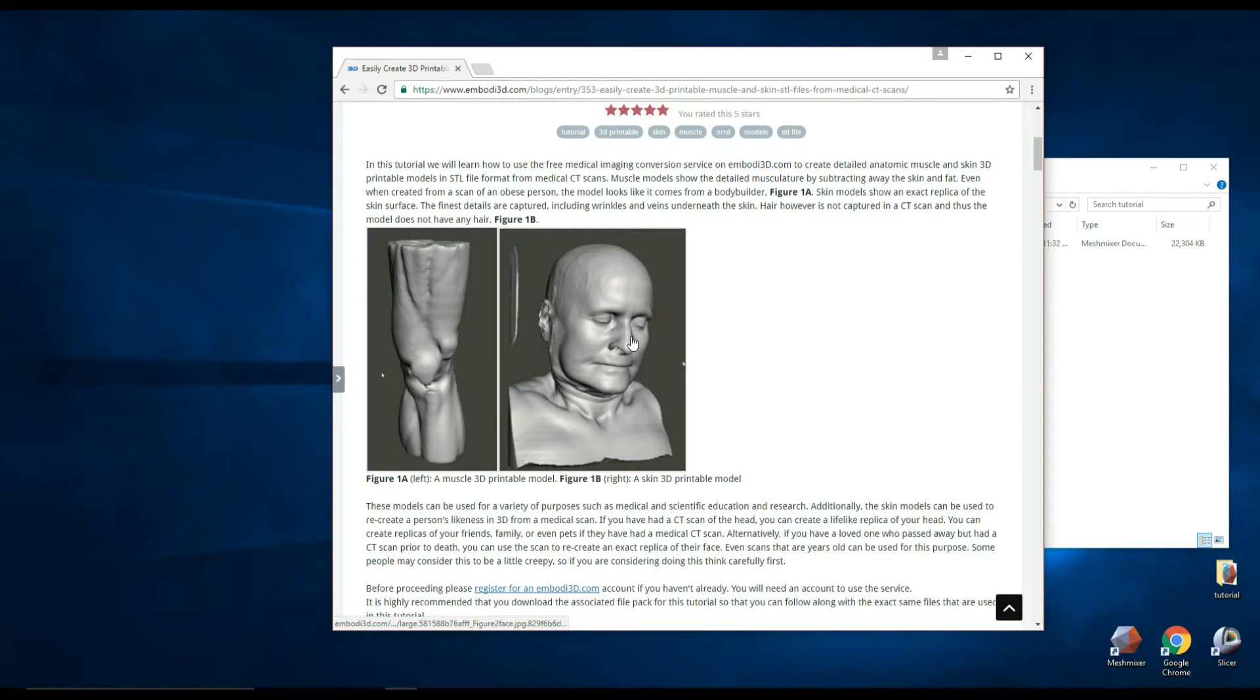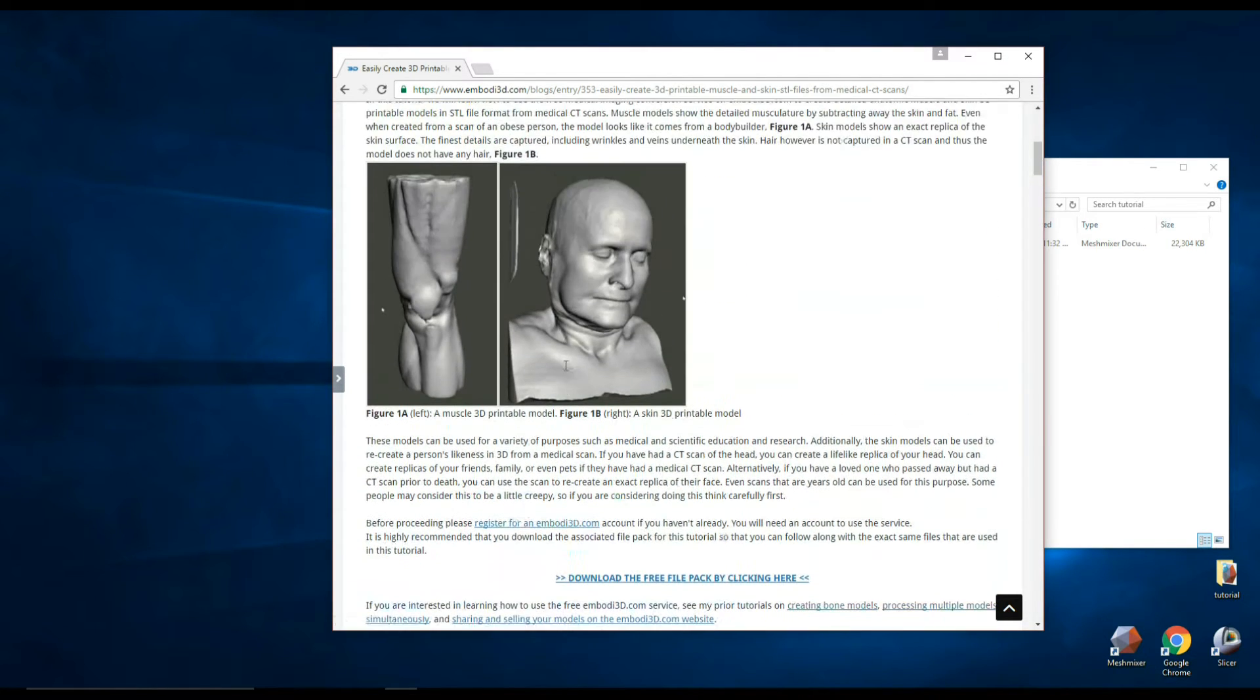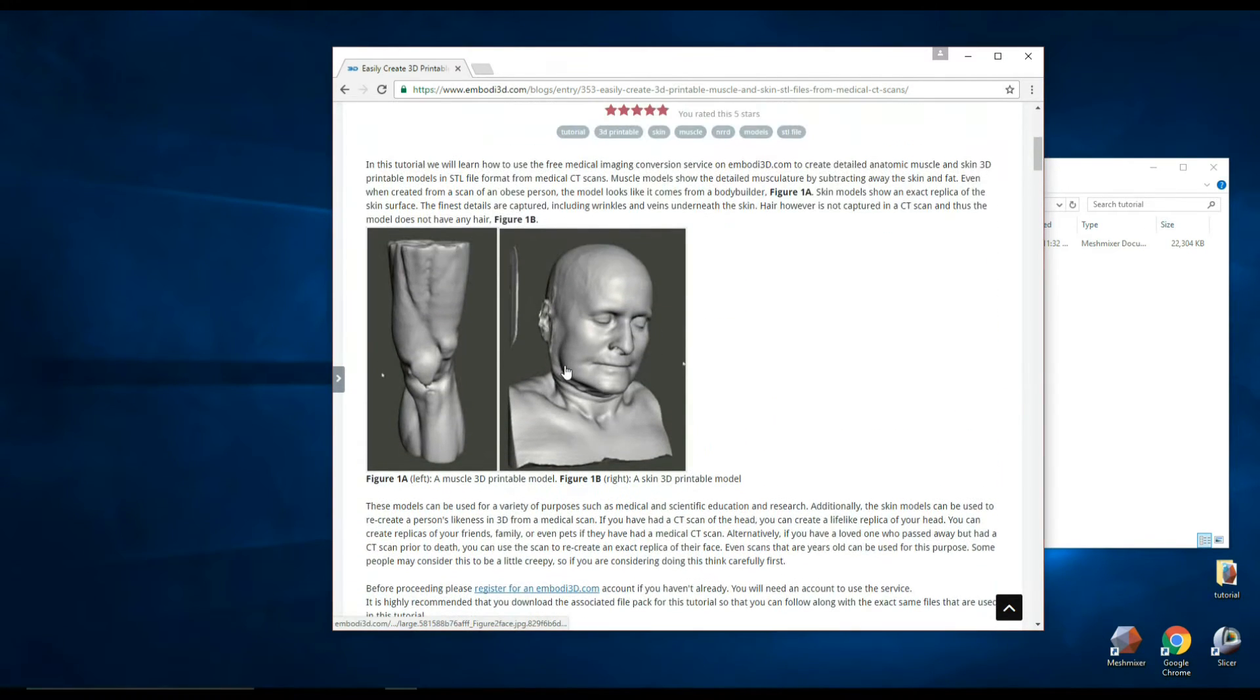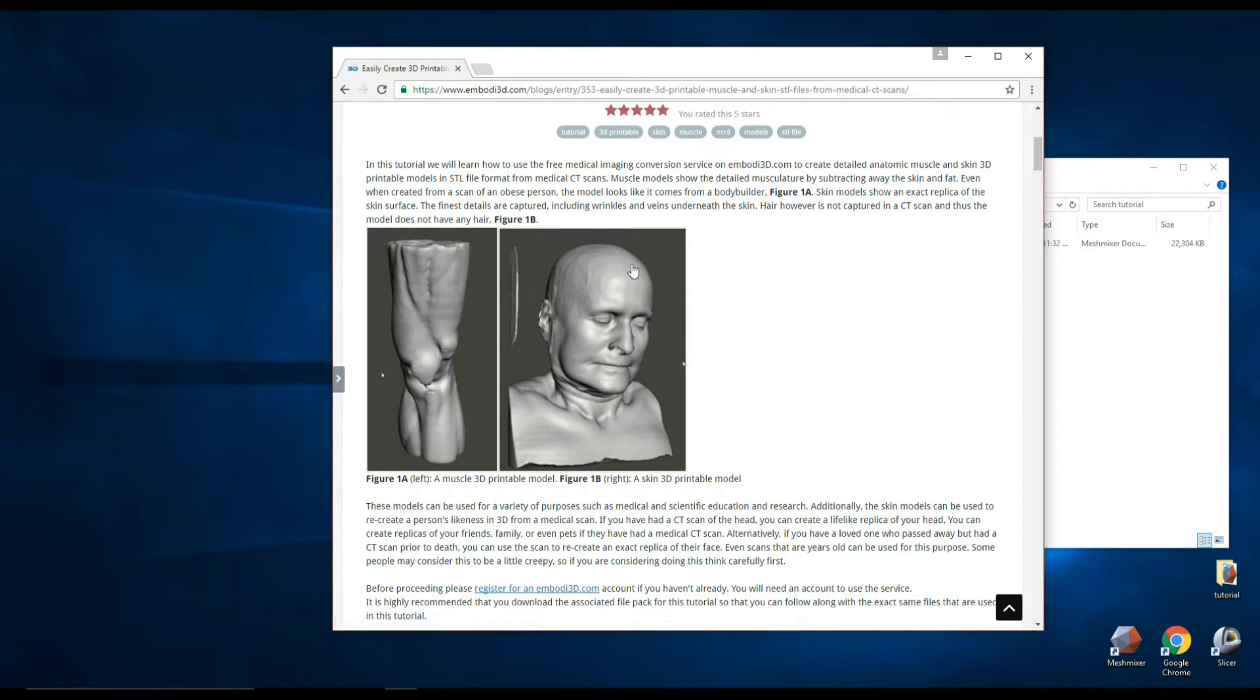I've received a lot of interest about my last tutorial which is how to make 3D printable muscle and skin files from medical CT scans. You can see that these are some of the files that we made. People have asked me how they can create a hollow shell from these models.